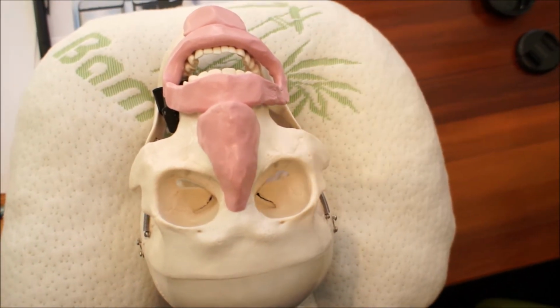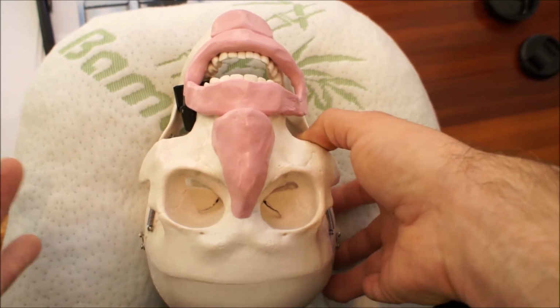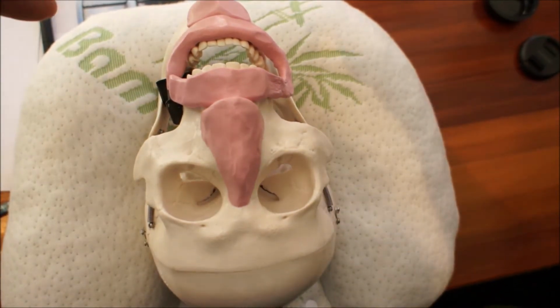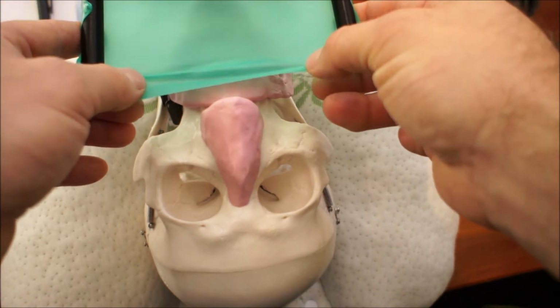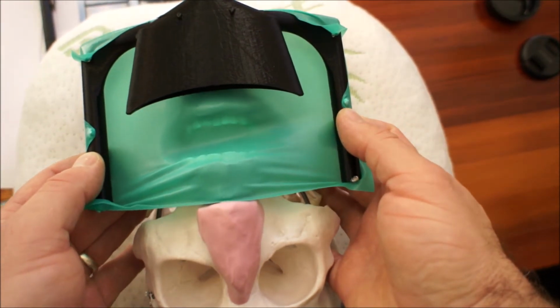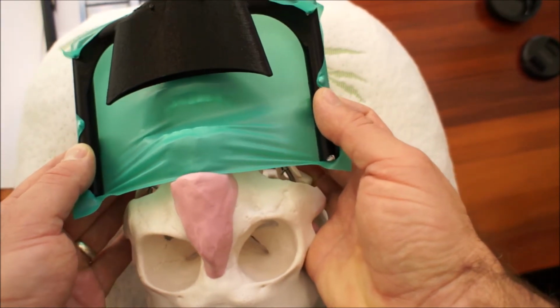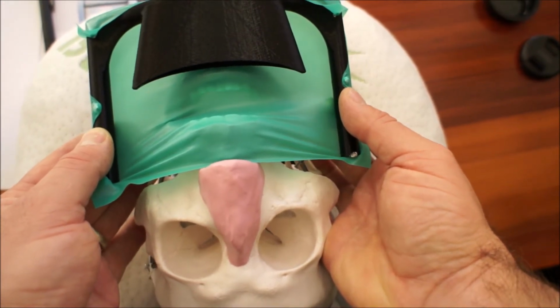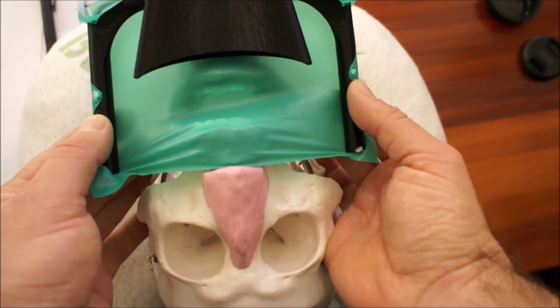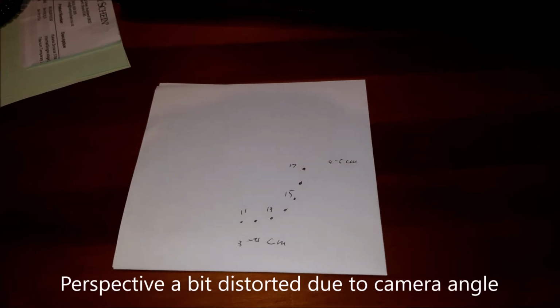The dummy that I'm using is not ideal. Looks like a high school plastic skull, and I've done a rubbish rhinoplasty on it. But just for illustrative purposes, you can see the edge of the rubber dam positioned at the inferior border of the nose, just there where the orbicularis oris attaches to the nasal process. This will position the chalice, the suction generating device, just level with or just below the lower lip, and also give you optimum suction.